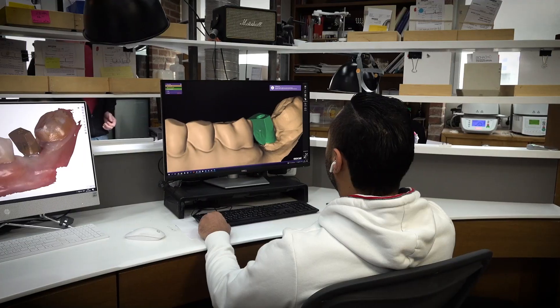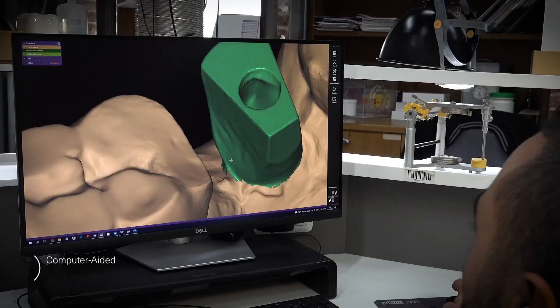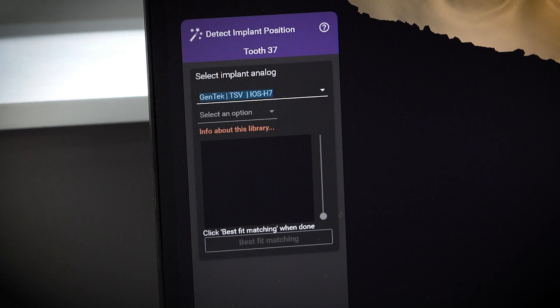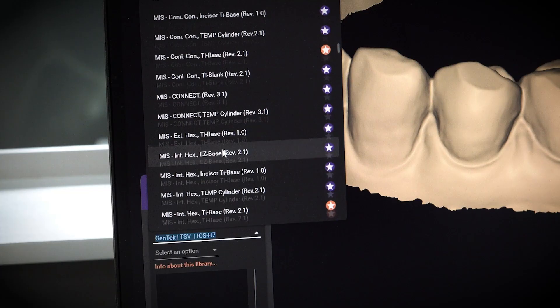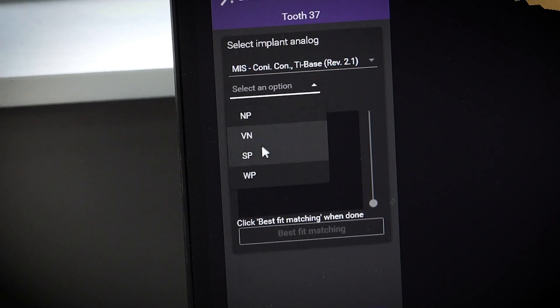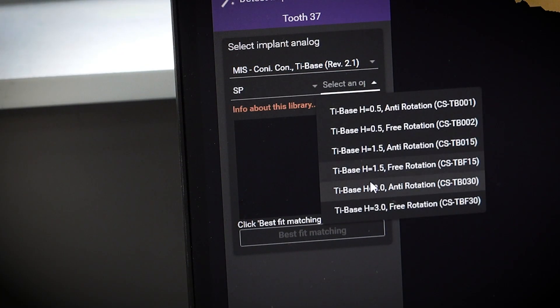The scan files are uploaded to the CAD software of your choice. In this video, the procedure is demonstrated using ExoCAD. Find the MIS library and choose the correct tie base by the following parameters: implant connection type, implant platform, and gingiva height.